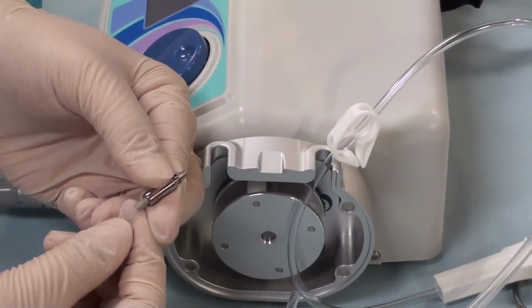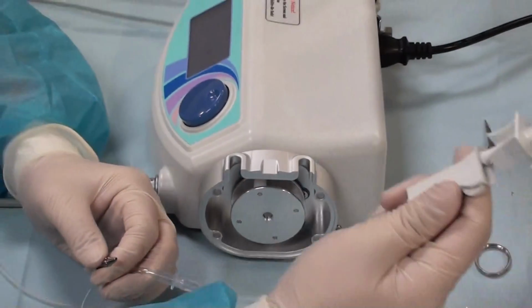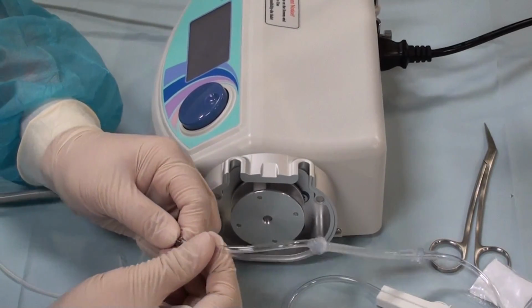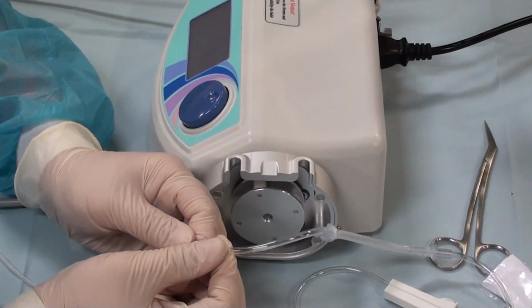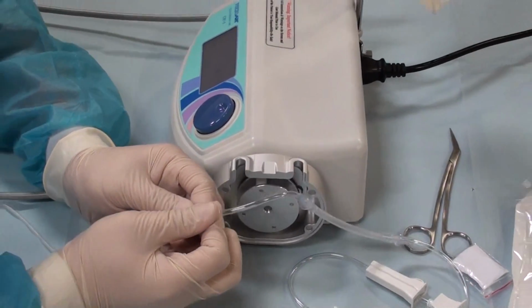So once it's in, you get the other side, the side that you cut, and at the other end of it you still see the spike. So you put the tubing around the wider nipple. You want to make sure it's in there real nice and tight.